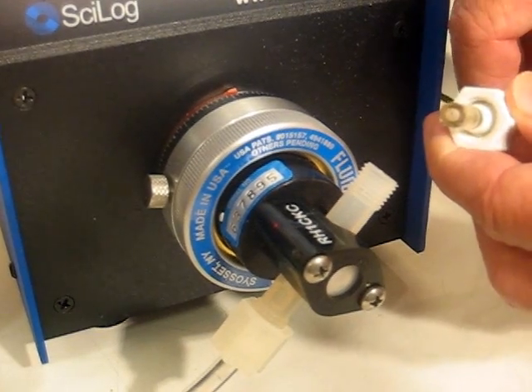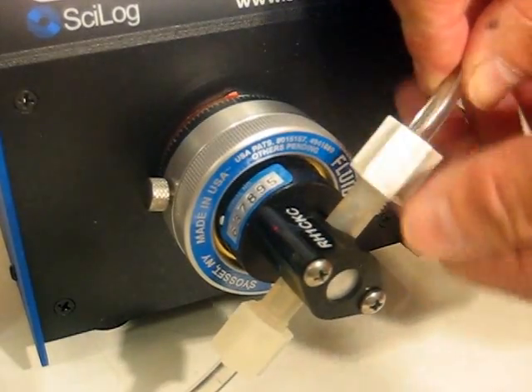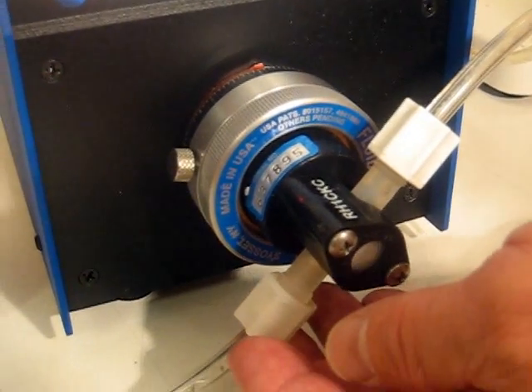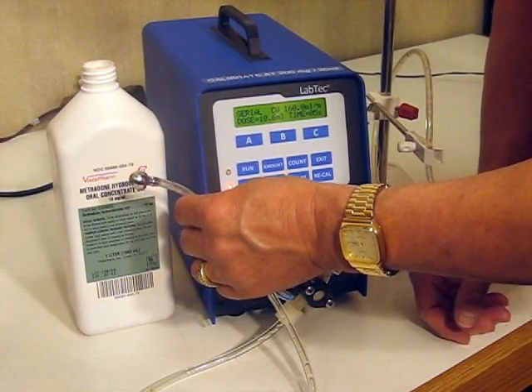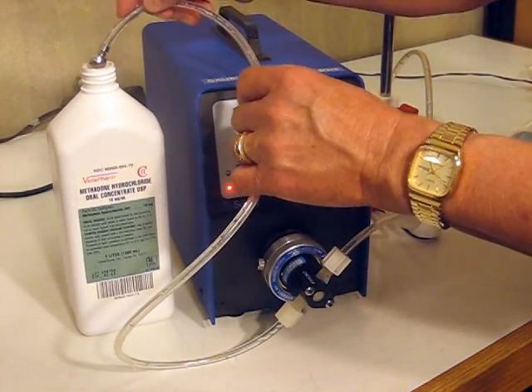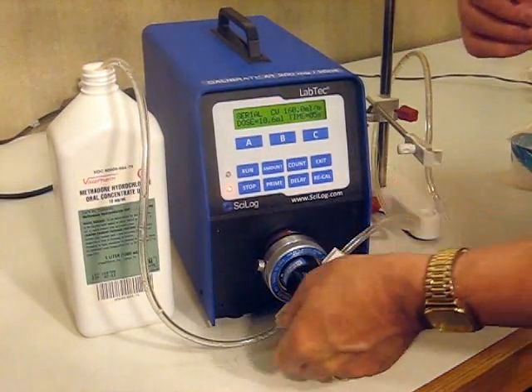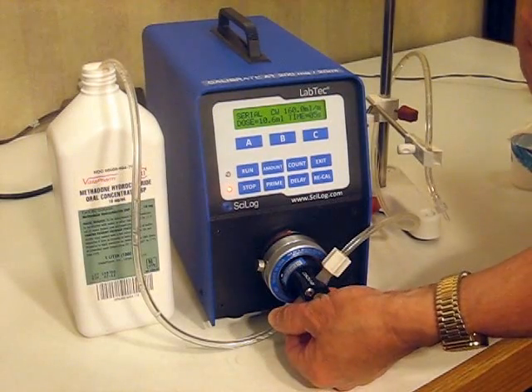This has a compression fitting on it. This goes inside of the piston head and screws on. This is the intake side. This tubing has a sinker on the end of it. This then goes into the bottle of Methadone. The sinker keeps the tubing at the bottom of the bottle. This is the tubing that is on the intake side of the piston head.